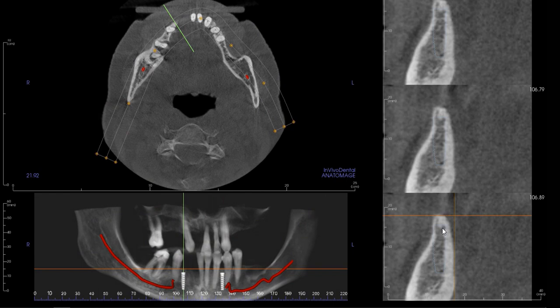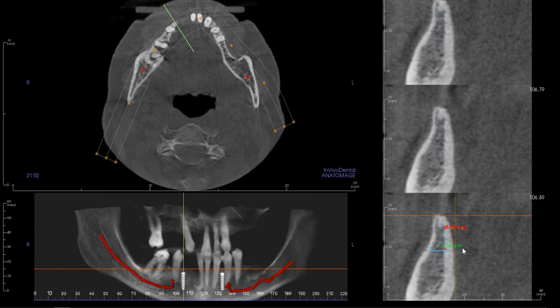His recommendation for these ridges when they're very thin at the top is that we reduce it and then have the head of the implant within a better cancellous-to-cortical bone ratio, which would probably be right about here. If you were to take this approach — which would definitely be my recommendation — you're looking at about eight millimeters of reduction, which still leaves you a massive amount of bone to place a nice implant for this patient. The downside is you need to lay a flap and be more aggressive with your surgery. What it's going to involve is extracting all the teeth, laying a full flap, and flattening the ridge until your ridge width is seven millimeters. That seven millimeters gives us a four millimeter implant with 1.5 millimeters of bone on either side.